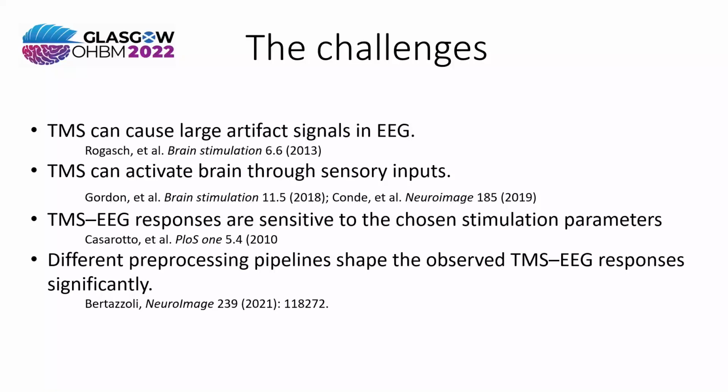On the other hand, we have learned quite recently that the TMS activates the brain not only directly transcranially, but probably also through sensory inputs due to the vibrating coil, which causes a clicking sound, and possibly direct sensations through the scalp nerves and so forth.